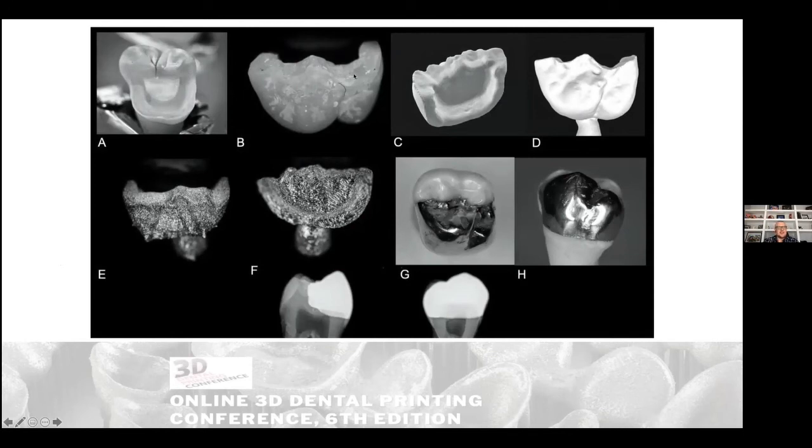This is just a chairside temporary. This is quite easy to do, a few minutes. Any dentist can do it. What we've then done is we've digitized that temporary filling, and we've sent that file off to 3D printing. And this was in chrome cobalt. We then cemented it on the tooth, and then we assessed it radiographically.